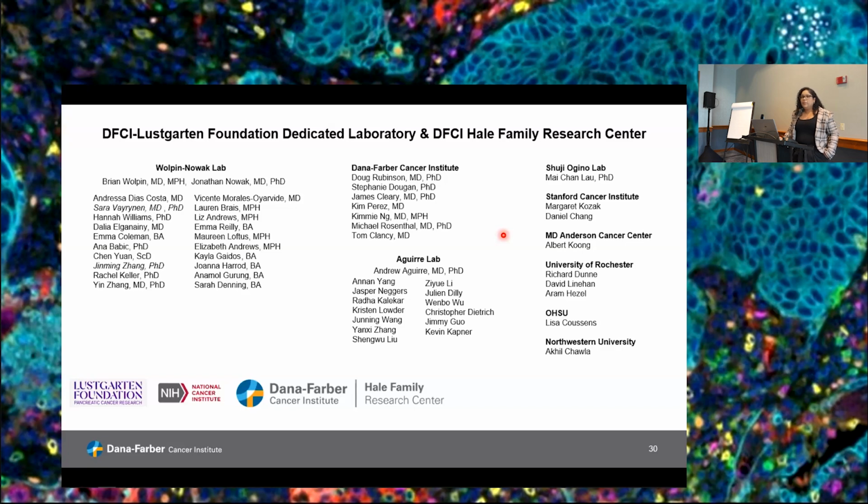Yeah, no, definitely 8 is not enough. The panels were customized for specific questions. I think they work pretty well if you want to be more granular and know not only that it's a T cell, but what kind of T cell, what kind of macrophage. They are great for that purpose. But as I mentioned, we wanted to have everything combined in the same panel. So what is the relationship between M1 macrophages and cytotoxic T cells that are now in different panels? Ideally, we'd like to combine the most important markers in each of these panels, and this is the direction we're taking now, to see in the same tissue where they are located, how they are interacting with each other.